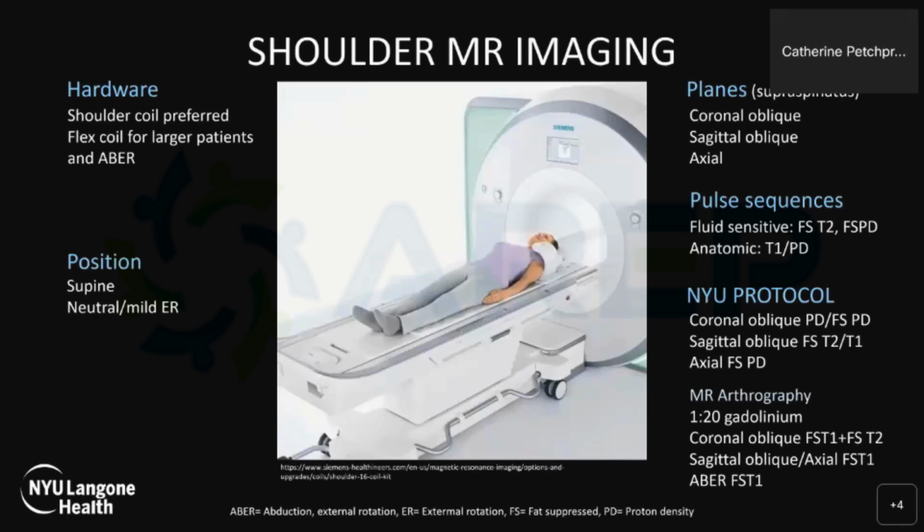First, let's image the shoulder. MR is the imaging modality of choice for the evaluation of internal derangement. When properly done, it provides a high-quality, standardized, and comprehensive assessment of shoulder bone, joint, and soft tissue. Coils play a major role in overall image quality, so choose a shoulder coil whenever possible. A shoulder coil places imaging elements close to the shoulder and is configured to provide the best imaging. When a shoulder coil isn't available or doesn't fit the patient, a flexible coil can be placed in a way to conform to the contours of the shoulder.